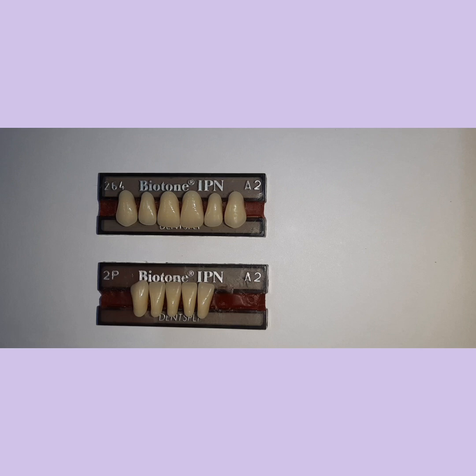the selection of teeth. And moreover, very importantly, that's the anterior teeth. So, whenever we talk about anterior teeth selection, we have to select the teeth in such a way that we can give the patient the aesthetics, we can fulfill the aesthetic as well as the functional requirement. So, in order to achieve that, we need to arrange the teeth in a natural position and, as I mentioned, according to the patient's demands.